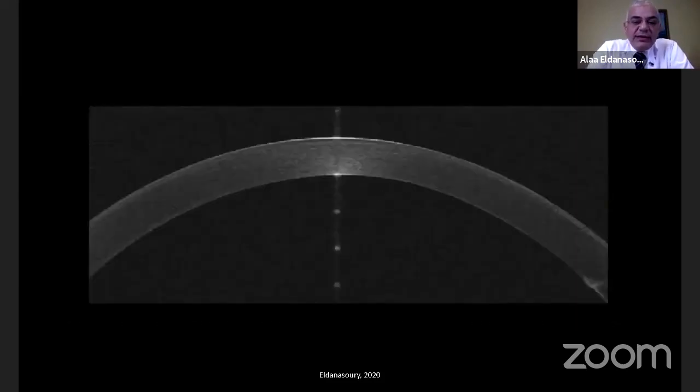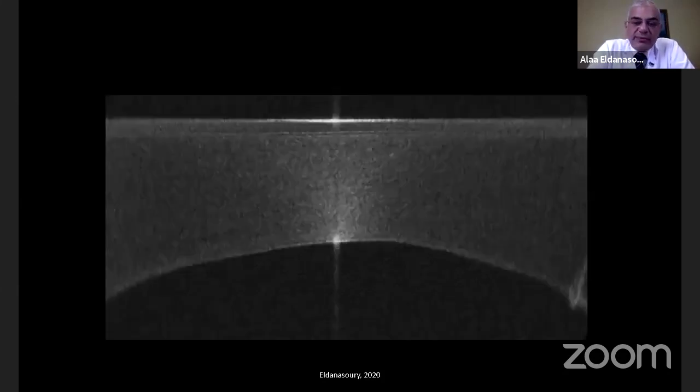And you see all the details of the cornea, and as I'm going to show you in a few minutes, preoperative and post-operative, post-laser refractive surgery, you can know the thickness of the remaining stromal bed if you're planning an enhancement. You can see the Bowman's layer, you can see the endothelium and Descemet's membrane. And with this anamorphic image of the cornea, which is something really new but very helpful, you can see in detail the epithelium, the Bowman's layer, and also the back surface of the cornea. And you can detect any early asymmetry on the back surface of the cornea, like in this case.